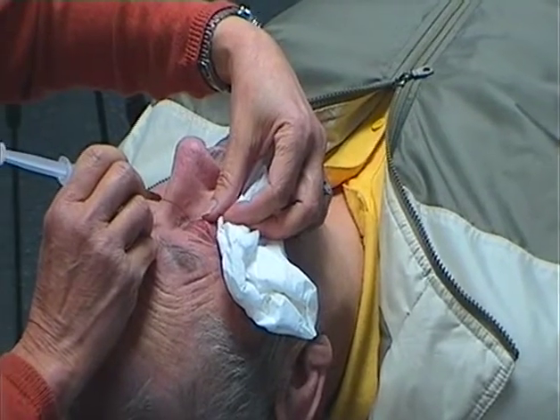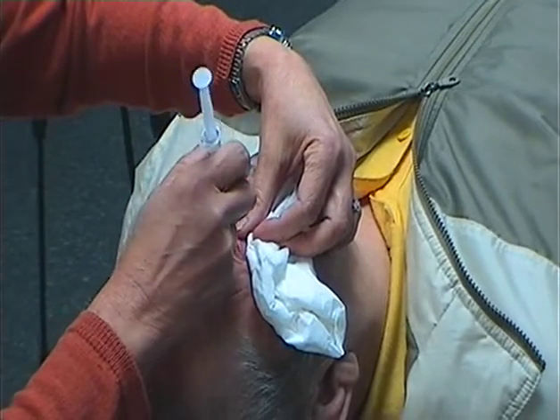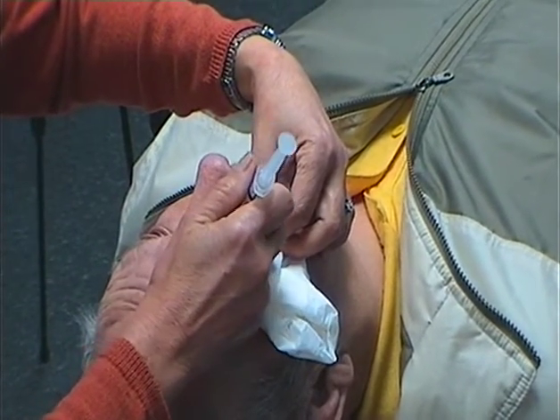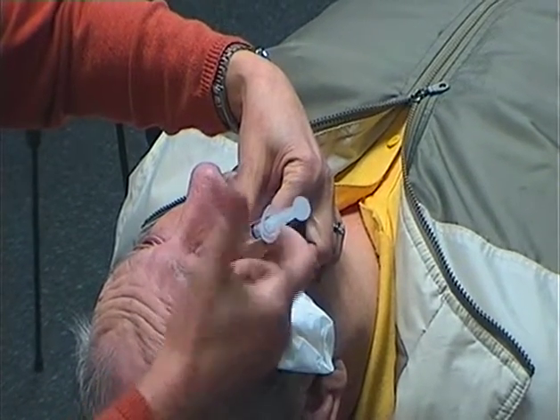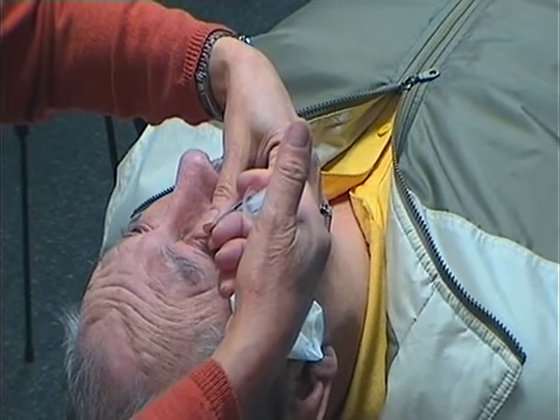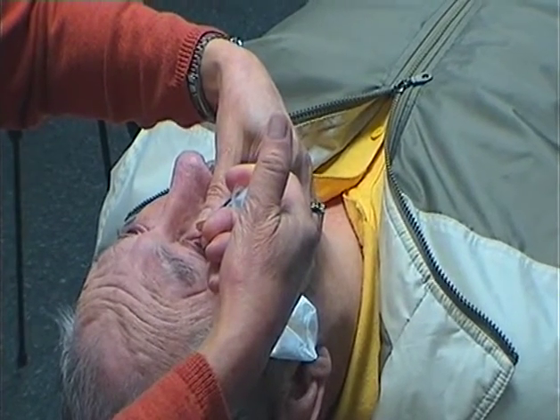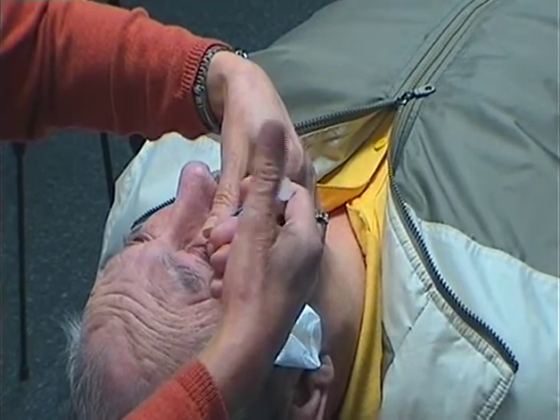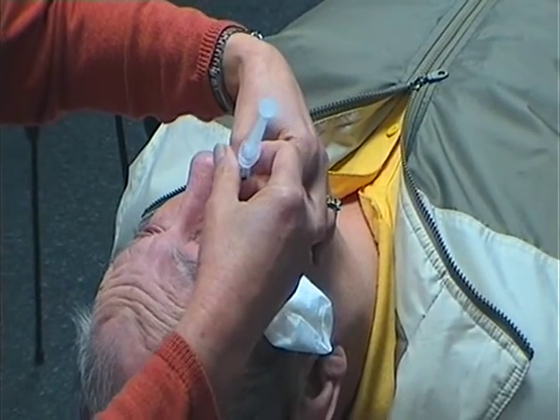Lavage of the lacrimal ducts has been a diagnostic and therapeutic procedure since 1910. In the intervening 100 years, very little has changed to the basic technique or instrumentation. Syringing tear ducts is one of the first procedures we learn as ophthalmic trainees, and it is also one of the first we learn to delegate to nursing staff. This is because we find the exercise time-consuming, inconvenient, but generally little can go wrong.